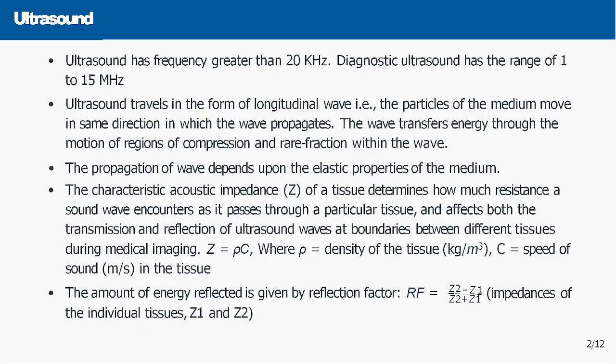The other difference is that electromagnetic signals are transverse waves, but ultrasound, or acoustic signals, are longitudinal waves.